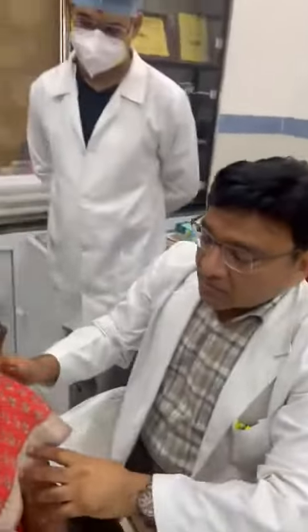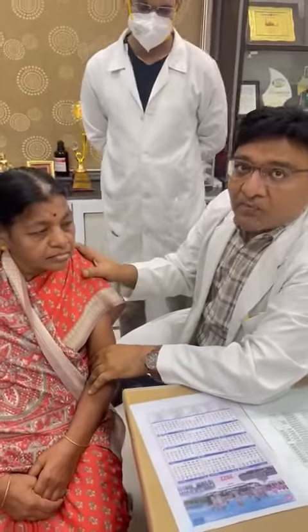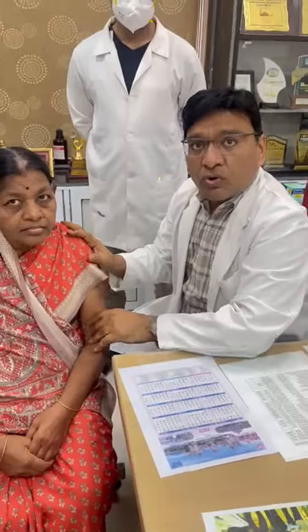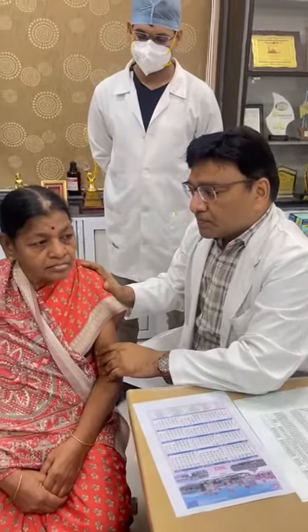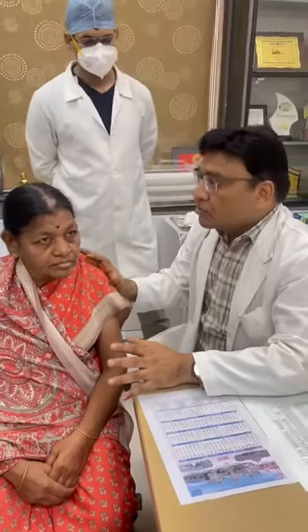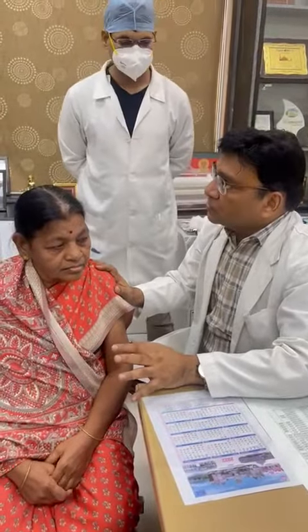Now we are asking her. Today she was operated — this is June 1st, today is June 1st. She was not listening for 4 years. She was on the TV after that.